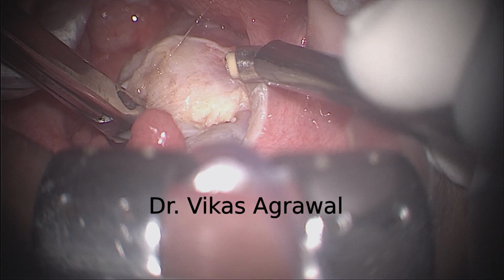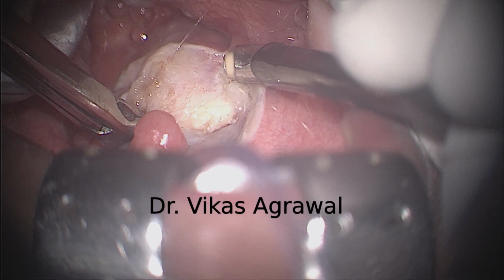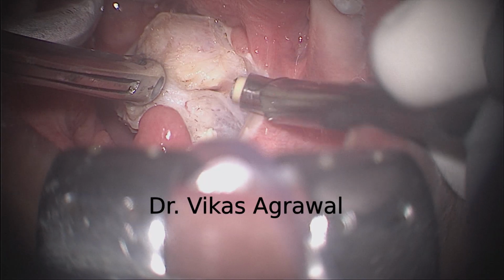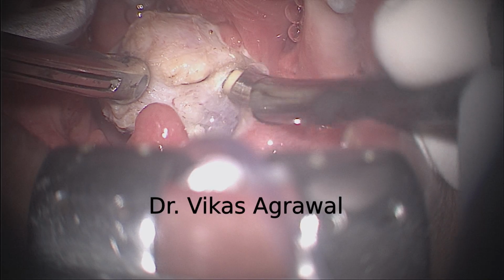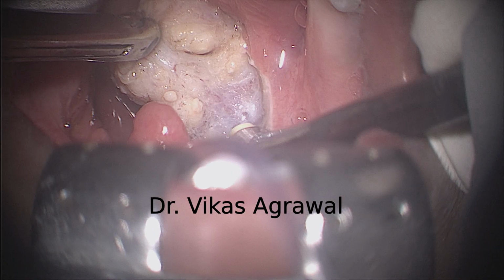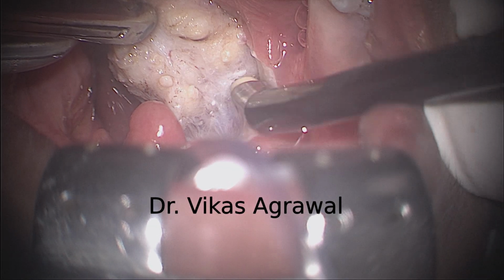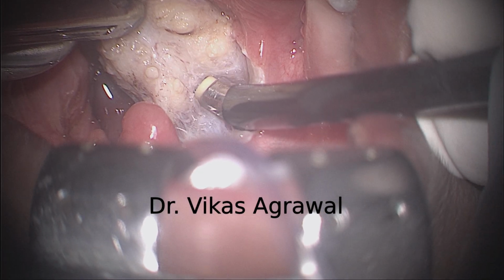Alright. Now I will further carry my dissection. See how large is the upper pole of the tonsil, and that is the cause of obstructive sleep apnea, which is getting removed. Now you can see there is no muscle exposure as of now. It is all connective tissue, so there will be no pain. It's like intracapsular surgery. Till this part, it will be a completely painless and bloodless procedure.